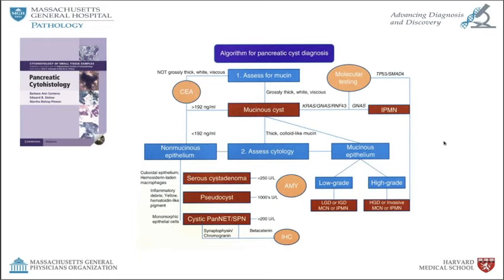Liquid-based processing is really only advantageous when the clinician thinks they're dealing with a serous cystadenoma. Let's say, for example, they aspirate a serous cystadenoma and they don't get much in the way of fluid, a drop, most of it's in the needle. There's not enough for you to really make a cytospin or send for chemistry. So what are you going to do with that? Well, rather than express it on a slide and traumatize the cells with mechanical artifact, rinse them in a liquid base, because it could rinse the cells out and preserve the morphology of the cells.